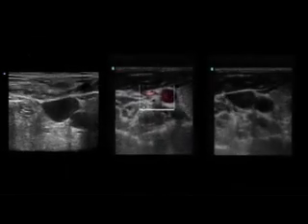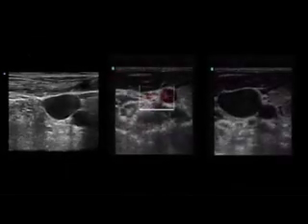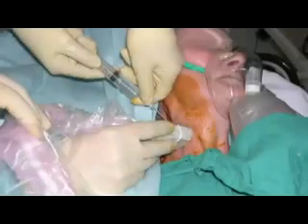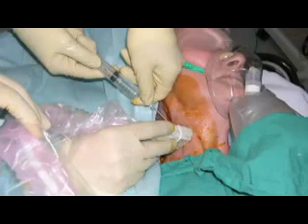The vein can be identified by compression, venous flow with Doppler, or increasing size with Valsalva maneuver. Placing the patient in the Trendelenburg position or having them perform a Valsalva maneuver may significantly increase the size of the internal jugular vein. The position of the patient's neck can also influence the relationship of the vein and the artery. Turning the head may cause the artery and vein to overlap rather than be side by side. Holding the probe in a more anterior position, parallel to the floor, rather than laterally, will also help to align the vessels in a side-by-side position.